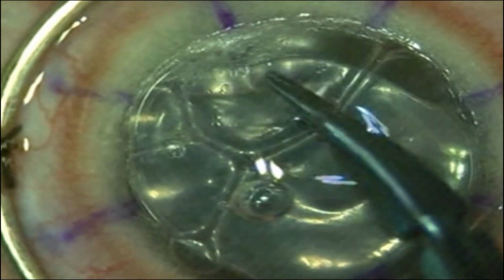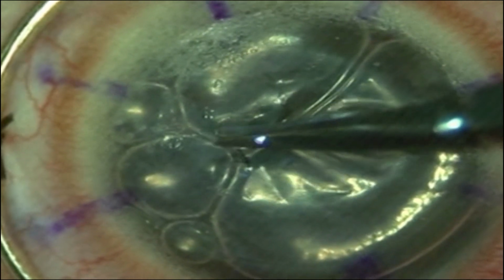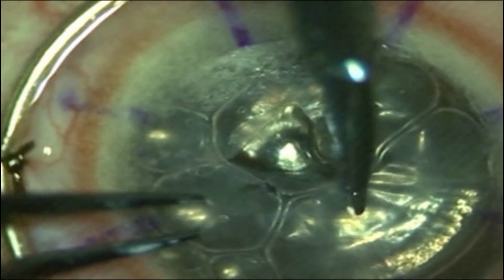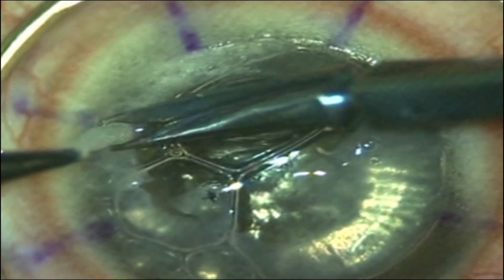Stromal dissection was carried out in multiple quadrants, exposing the underlying Descemet's membrane. The area which was not separated in the periphery was dissected manually to facilitate suturing.